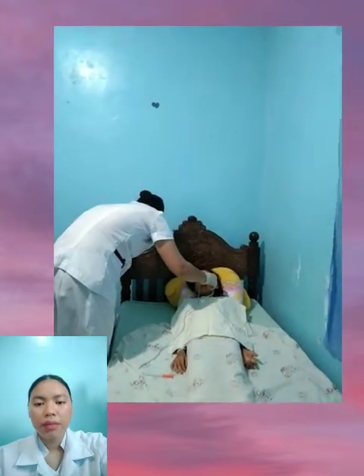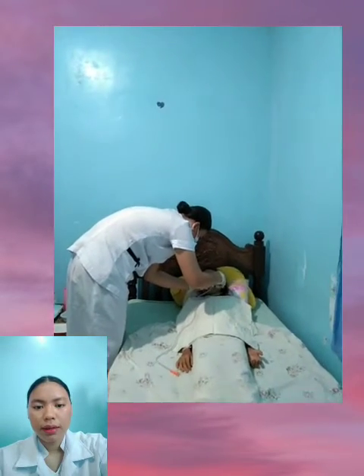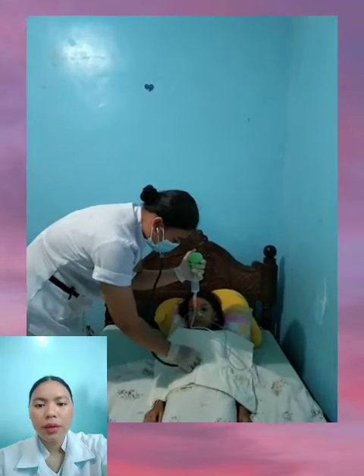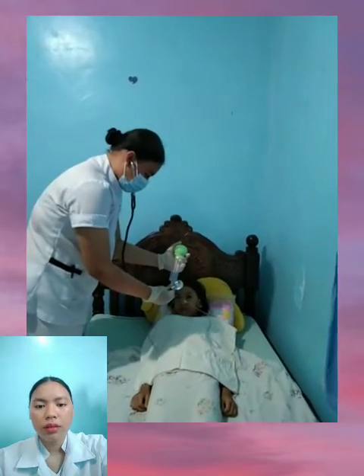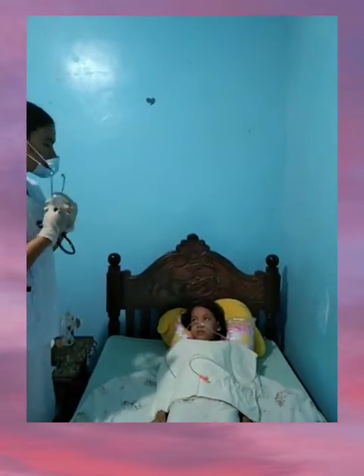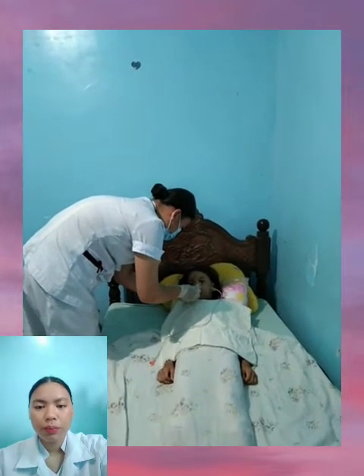Ascertain correct placement of the tube. Aspirate stomach contents and check the pH, which should be acidic. Confirm by X-ray. And place a stethoscope over the client's epigastrium and inject 10 to 30 ml of air in the tube while listening for a whooshing sound. Secure the tube by taping it to the bridge of the client's nose.